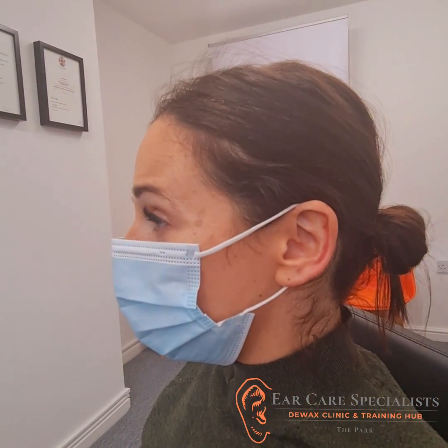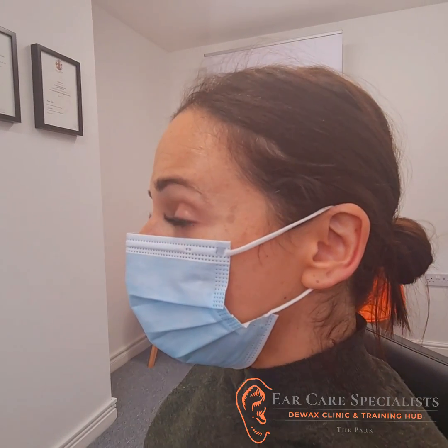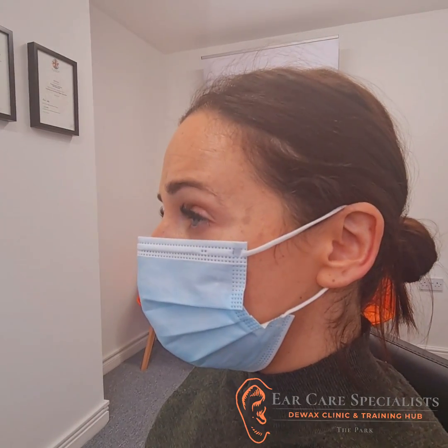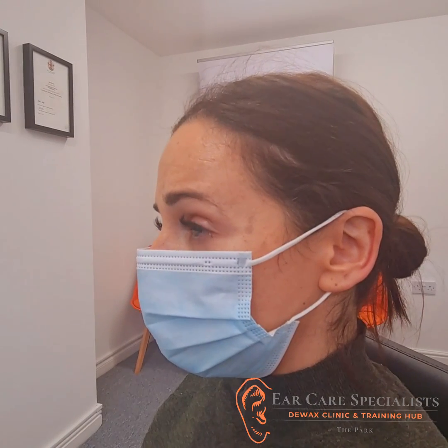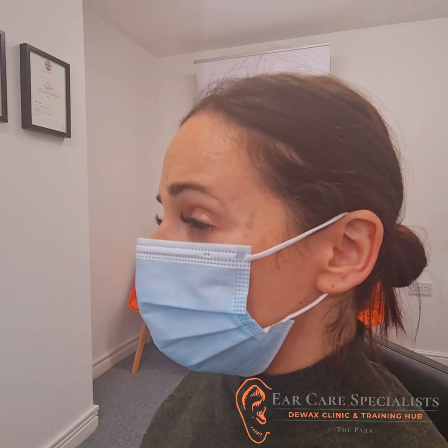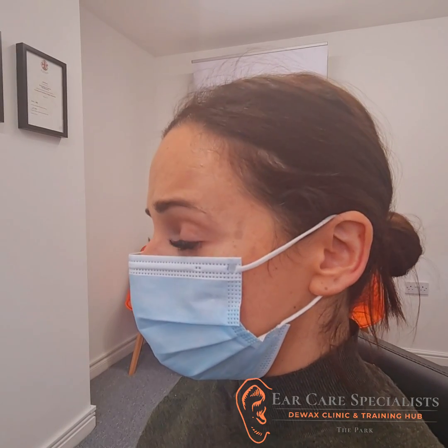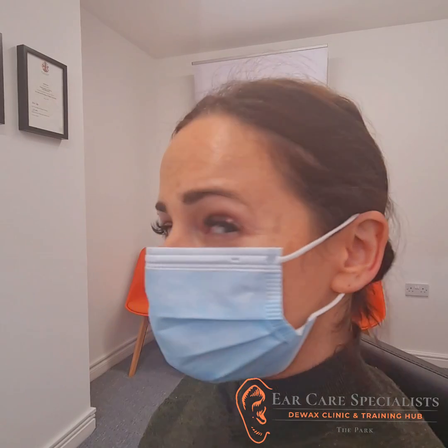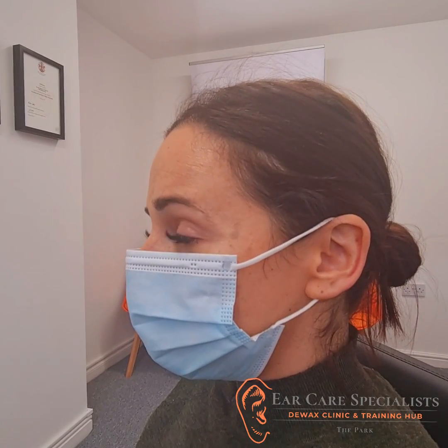As I was just saying to you before, we're going to slowly insert the Ear Waze device into the ear. The idea is that it wraps around the earwax and then corkscrews it out. When it's going into the ear, you are going to feel some pressure, so it will feel a little bit strange. If it's painful and you need me to stop, then by all means just let me know and we will stop as is safe to do.